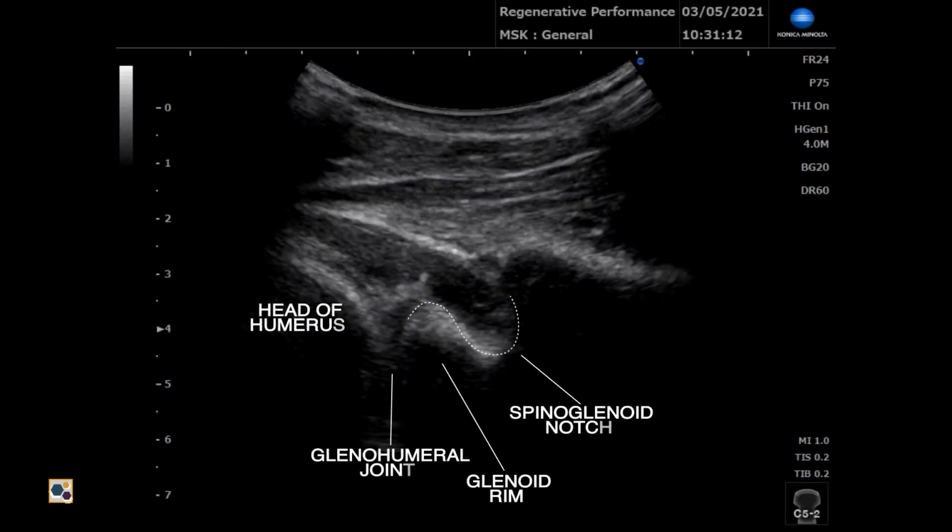And what was interesting during our injections is that on the posterior aspect, when we were injecting at the most posterior and inferior aspect of those ligaments from the glenoid onto the actual humerus, and we were at this point injecting onto the glenoid, we recreated some of those sensations of instability he was having in that overhead position. And so we haven't really seen that a whole lot, to be honest, where we recreate a sensation of instability, but it was familiar enough to him that it sounded like we were in the right area for that.